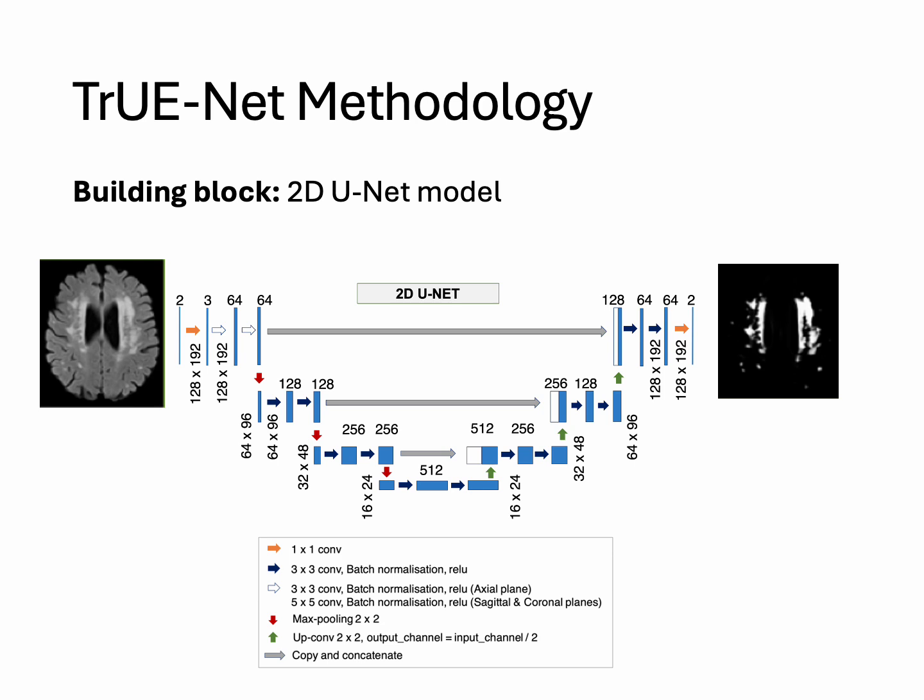That is recovered in the decoder end of the network by using what we call skip connection layers. These gray arrows mean that the activation maps from the encoder part are concatenated with the decoder end, which ensures that whatever texture information we have lost over the encoder layers is appended again to the decoder layers. We also have the location based information which we have preserved.